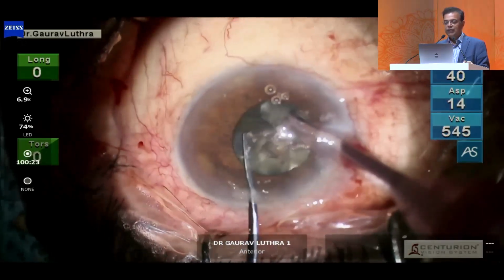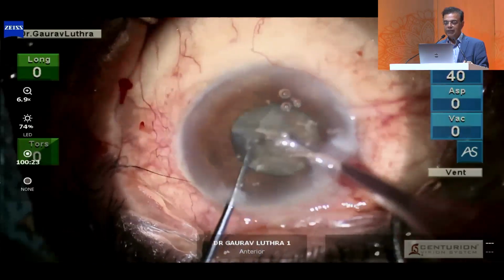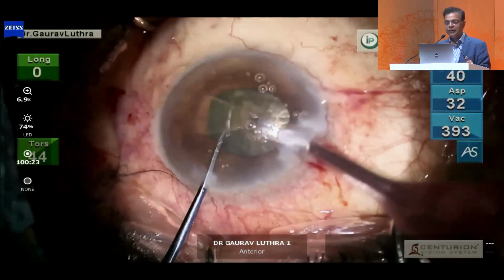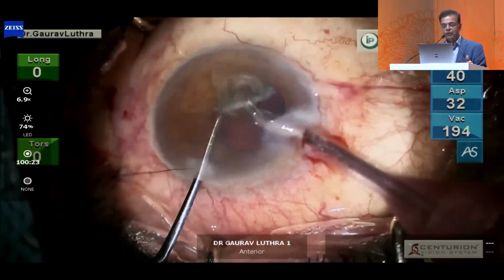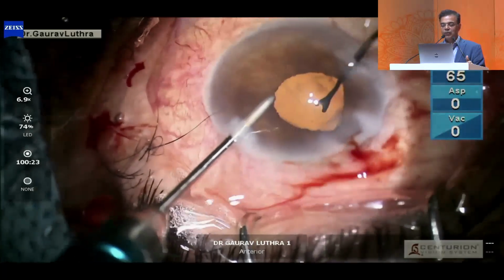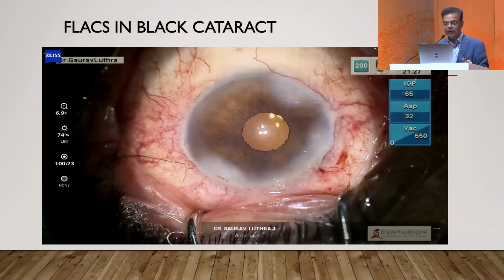And you can then have these cleavage planes, and as you can see here, it becomes much easier with very little force as compared to what you might do in a routine case like this. You can do a separation very, very easily. And once you've separated all the quadrants, it becomes nice. In fact, it's much easier to crack the posterior plate as well. And of course, it's a good idea to use a viscoat cover for the endothelium, and you can then go in with an injector system like this, which can deliver the lens straight into the pupil, into the bag. And you can see that the pupil did come down a little bit. So of course this was fast forwarded, but hard brown and black cataracts are a good indication for laser assisted cataract surgery.